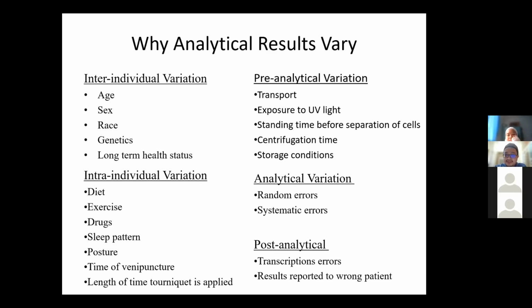Sebab hari itu ada 100 orang lebih patient datang hospital. So you're going to run. So the machine could accept 100 sample at a time. So when you put all 100 samples in from different individual, you then read the results.